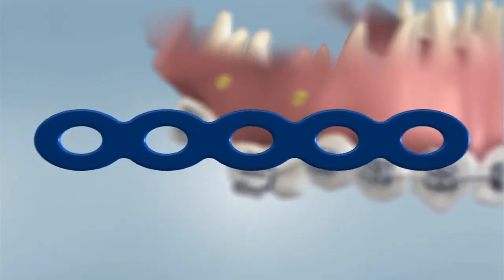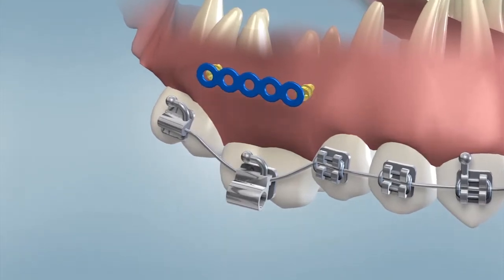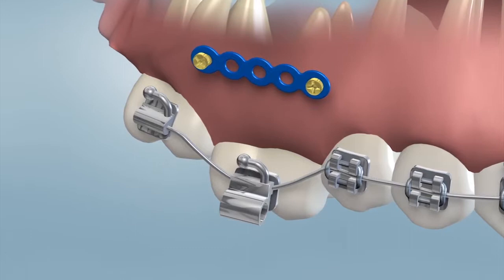A TAD is used in a situation where a solid anchor is required for the orthodontist to achieve tooth movement. TADs can also be used for patients who are missing permanent teeth.